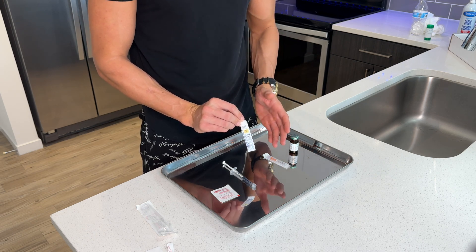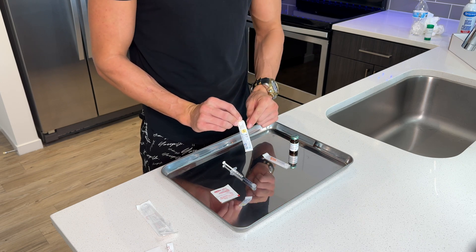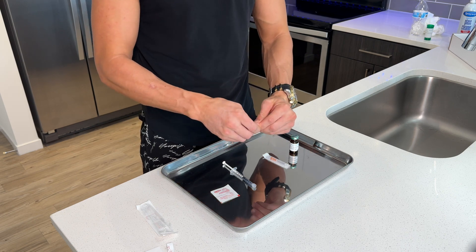Luckily, the clinic I work with is absolutely amazing at paying attention to detail and makes sure that all my supplies are sent directly to me. That being said, I get two needles. The 20 gauge one inch needle is just to draw out the testosterone. So we're gonna go ahead and open this up.